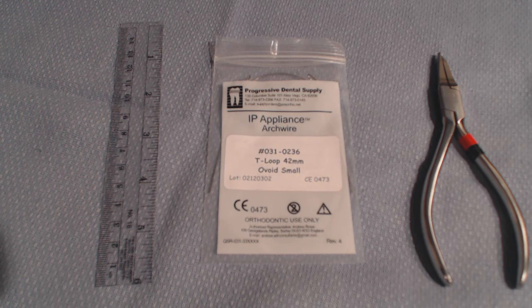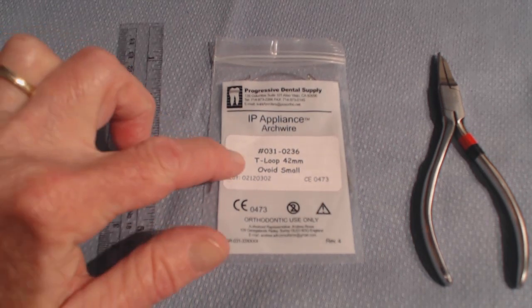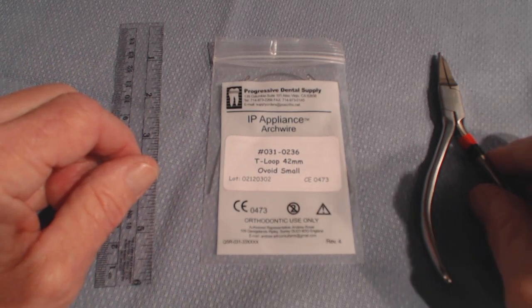The armamentaria for this are a millimeter ruler, a T-loop arch wire, and a tweed plier.